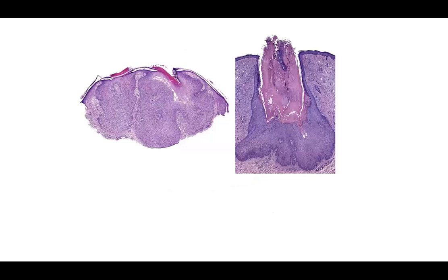Some people may mistake this for a basal cell carcinoma. It's not a basal cell. So from this power, you can tell it's well circumscribed. It's got an edge that looks like it's peripherally palisading. From low power, what's your differential diagnosis? What if you went on high power and found abundant clear cells making up this neoplasm and an eosinophilic rim to the outer edge?